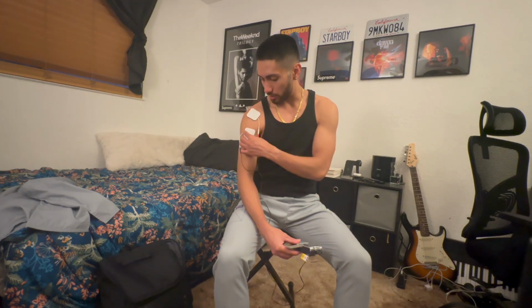Maybe we could turn that intensity down. Maybe it's a little too strong. No, this is comfortable. And obviously intensity is based on patient comfort. So if a patient would want to have very, very strong contractions and that's comfortable for them, sure. But maybe if it's just light like these ones, this is okay too, as long as we're seeing some sort of muscle activation going on.